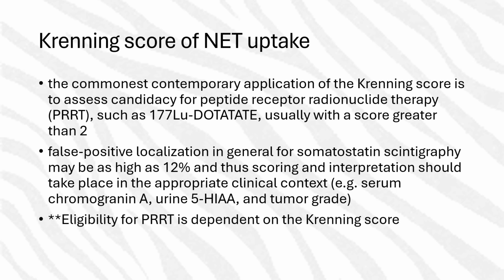False positive localization in general somatostatin scintigraphy may be as high as 12%, and therefore scoring and interpretation should take place in appropriate clinical context where multiple things are assessed to determine what their score is. And eligibility for PRRT is dependent on the Krenning score.